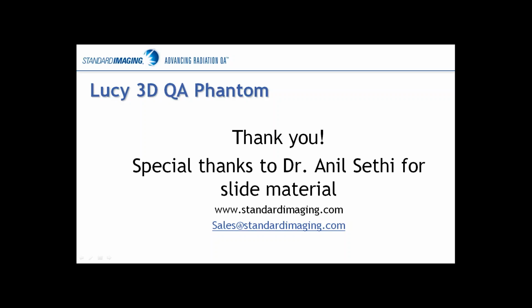And that stack of film, I believe, is around 3.5 cm tall, so we can get a nice assessment of a relatively clinically relevant region for a 3D type assessment. Obviously, you want to mark your pieces of film above and beyond the one that gets marked with the Lucy Phantom inserts. I would go ahead and mark each of my films so I know which one is which within that distribution.